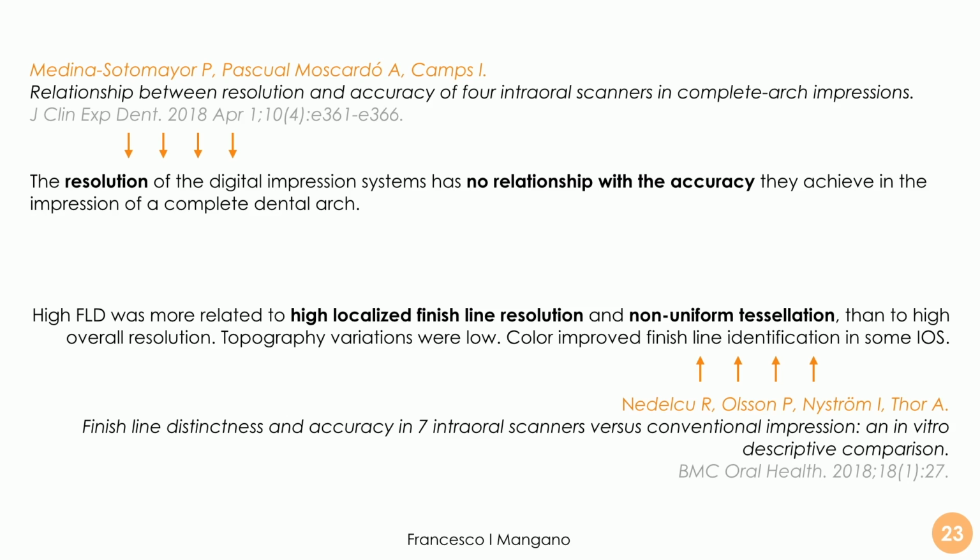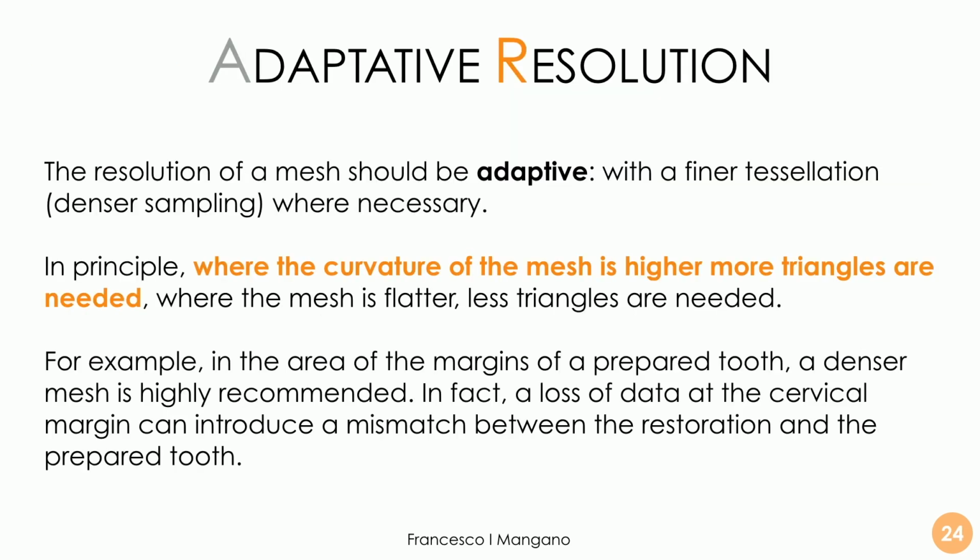In some software, we can also have the possibility to save the file, the output, into a polygon format that is an STL plus color, and this is not a real color, but it can help a little bit the dental technician. So once again, the concept of adaptive resolution is important.